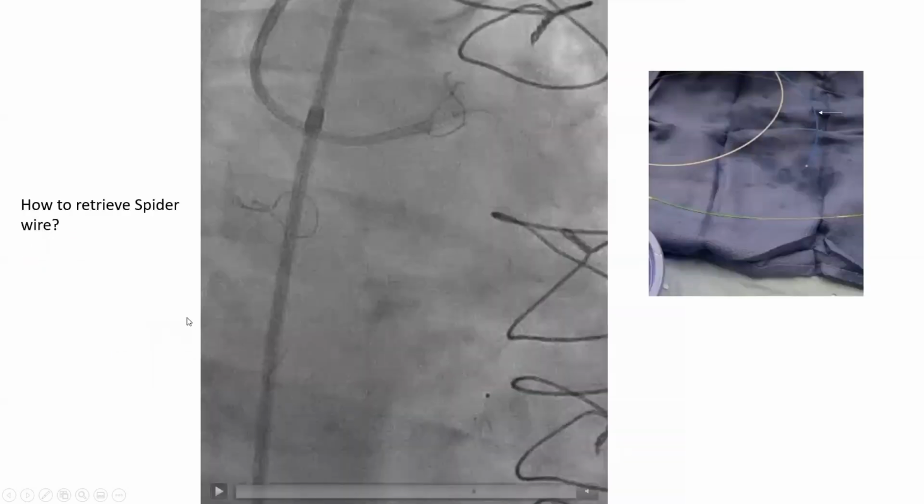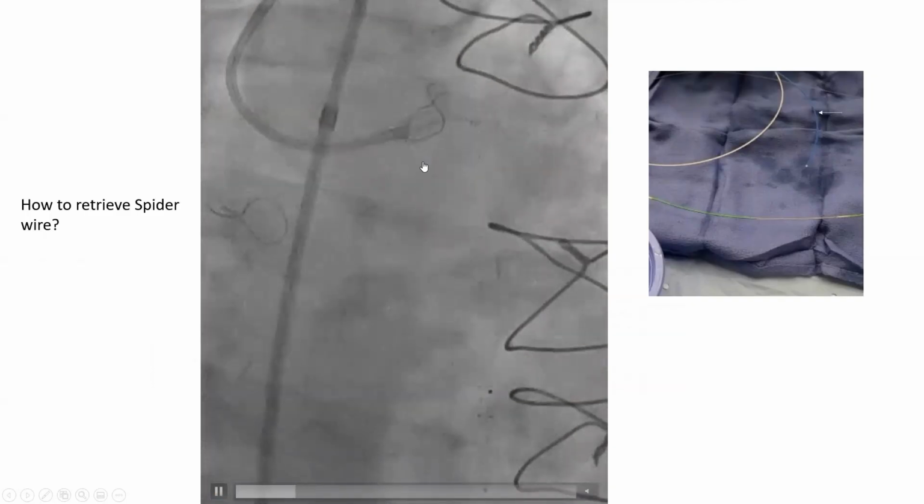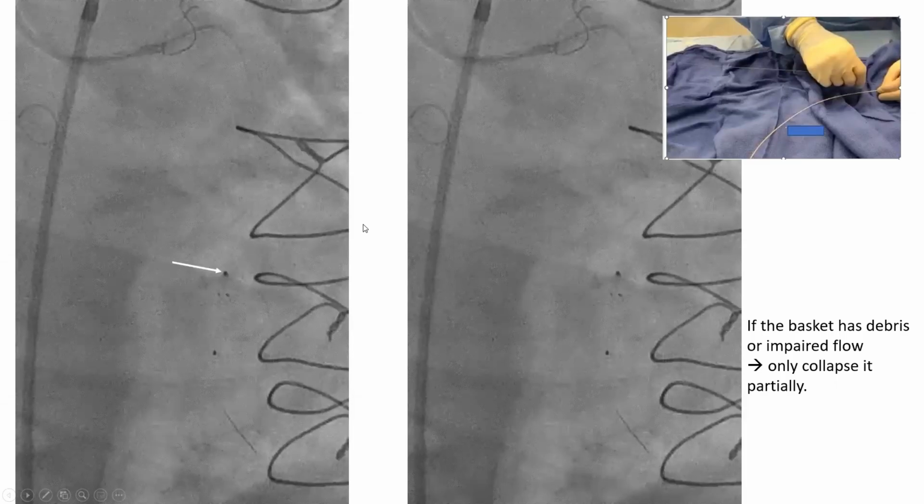Now, how to retrieve the Spider wire? We advance that blue retrieval portion in a monorail fashion, and you can see it here being advanced. You advance it until the tip of that catheter is superimposed on the proximal marker of the filter. Then we pull the Spider wire while simultaneously pushing the catheter with the other hand, until we collapse the basket. We typically push with this hand more than we pull, but the goal is to keep the basket in place, not to move it and create dissections. So you adjust your push and your pull accordingly.